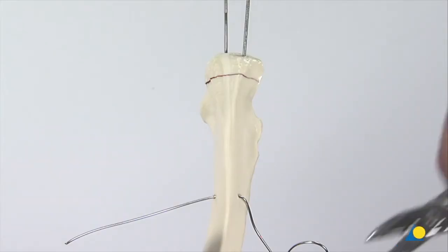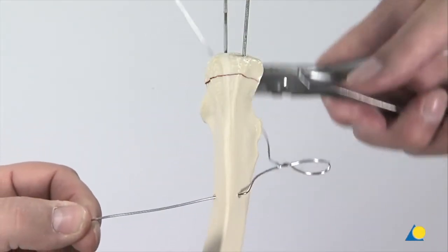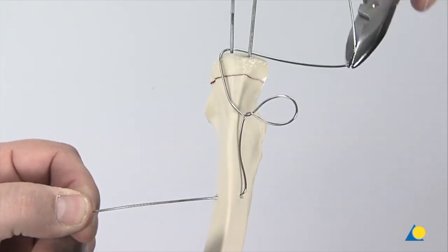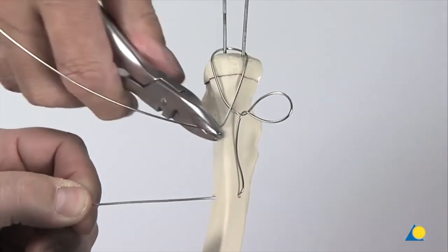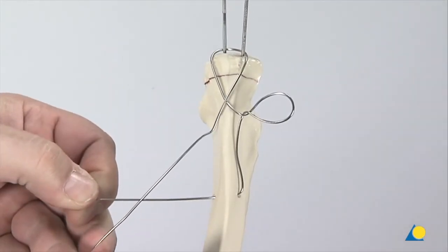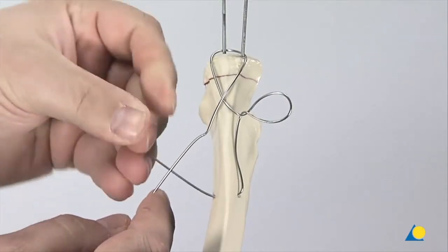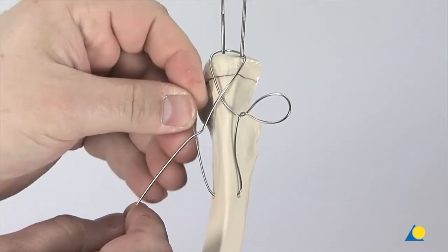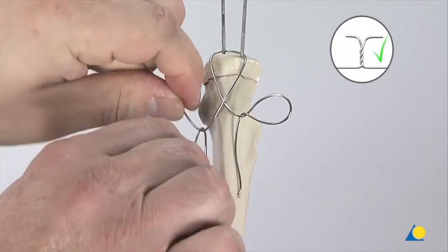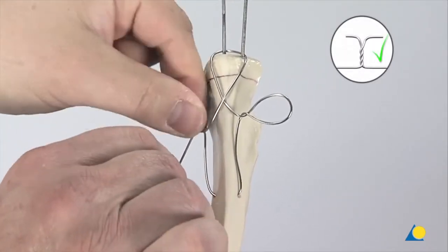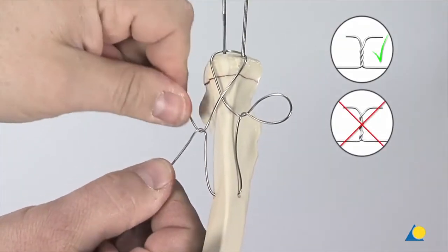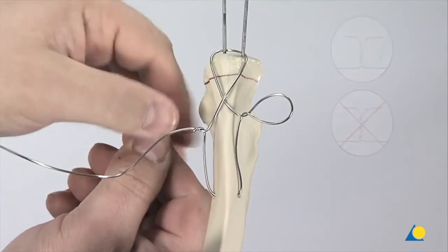The end of the circlage wire that has the loop is wrapped around the two K-wires in a figure of 8. In clinical practice, the wire is passed beneath the triceps tendon, just next to the bone. The two ends of the circlage wire are twisted together twice by hand. It is important that the wires be twisted symmetrically around each other and not one wire twisted around the other. Incorrect twisting results in a weakened construct that may fail under load.